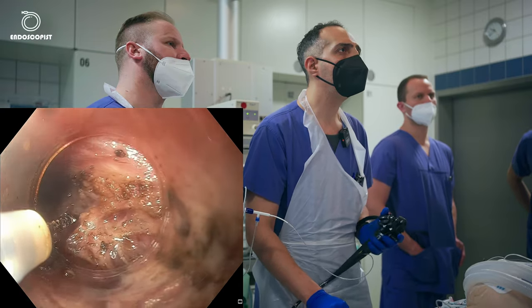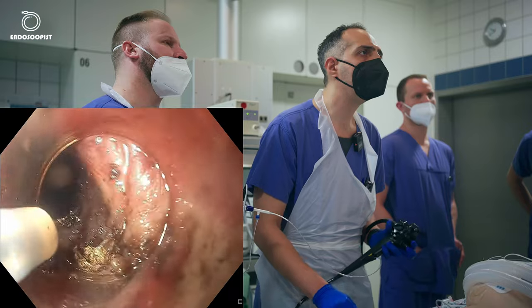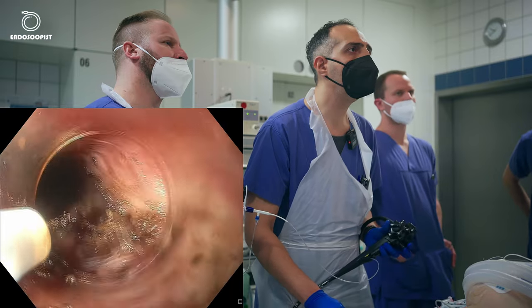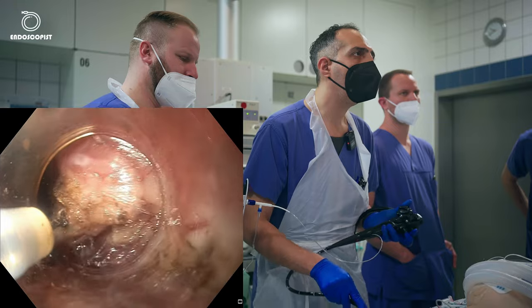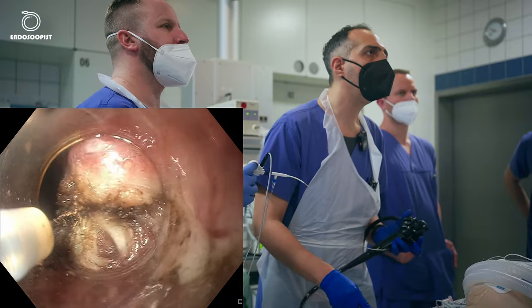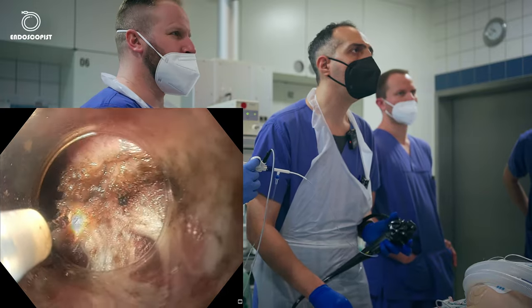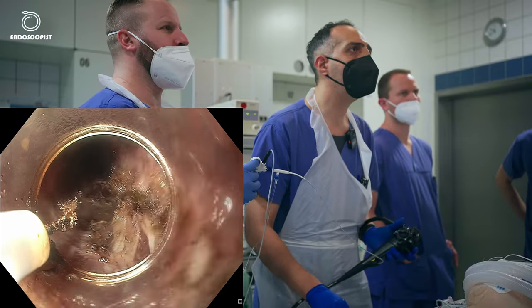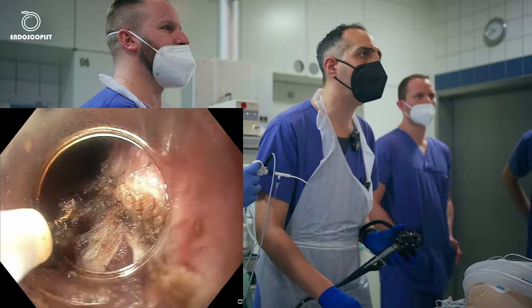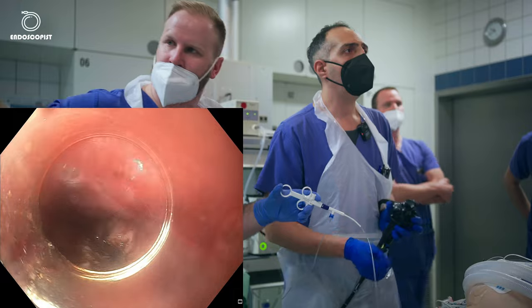I will go further backwards. Here I will cut this one. I will hook like this. And it looks fine. Very nice. I always love to see the longitudinal muscle fibers like here now. Okay. So I believe we finished our myotomy.